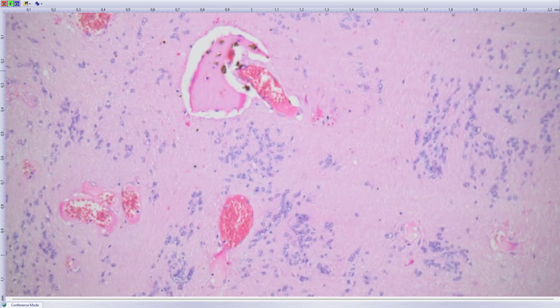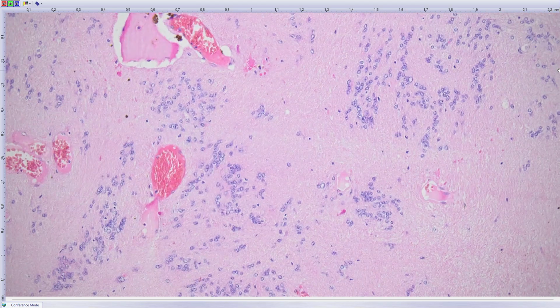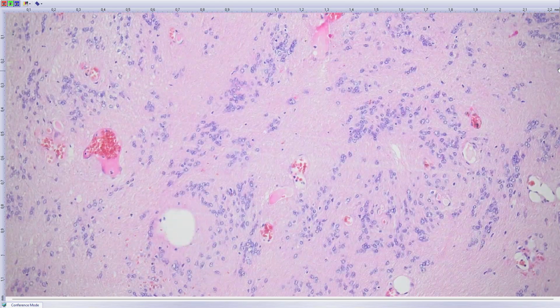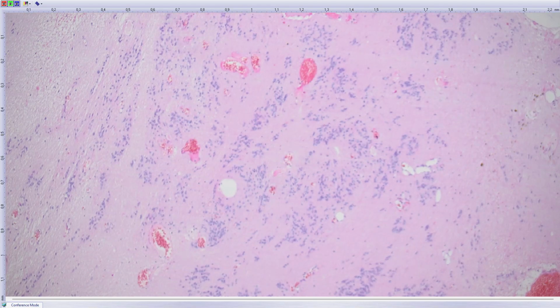And it came back with methylation profiling as subependymoma. Sometimes these cells may show degenerative, almost ancient schwannoma-like atypia. Sometimes there are microcysts present, sometimes there are microcalcifications, which helps in the diagnosis. I believe calcifications were present focally in this case.